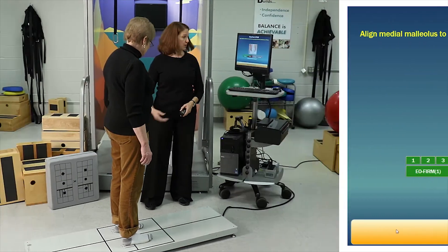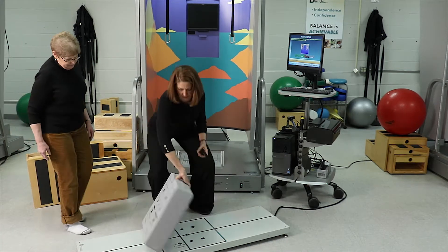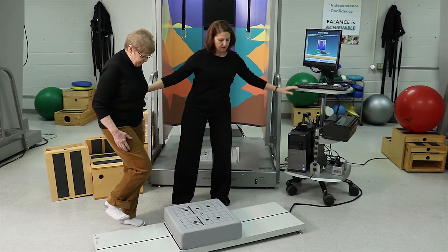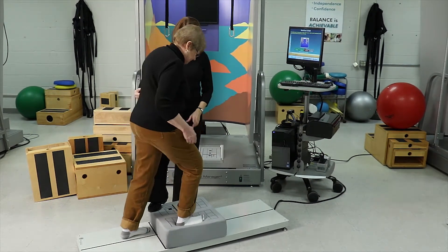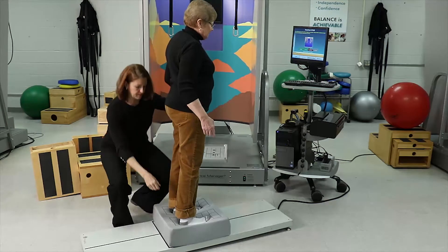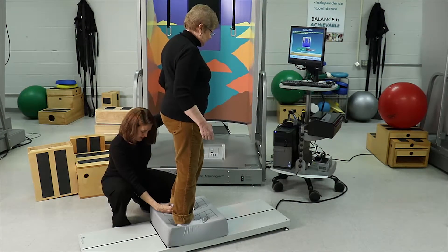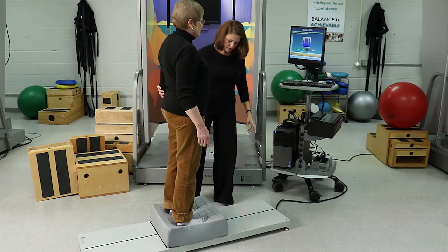Step off the force plate. I'm going to put a piece of foam up here — as you can see, the surface looks just like it did on the hard force plate. Climb up here and put the arch of your feet over those circles. I'm going to hold on to you a little bit while we move your feet to make sure they're in the right position. That one looks really good; this one comes back just a little bit. Can you balance there? You're in a good spot.